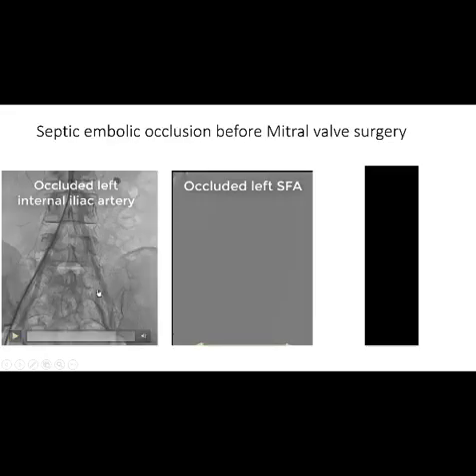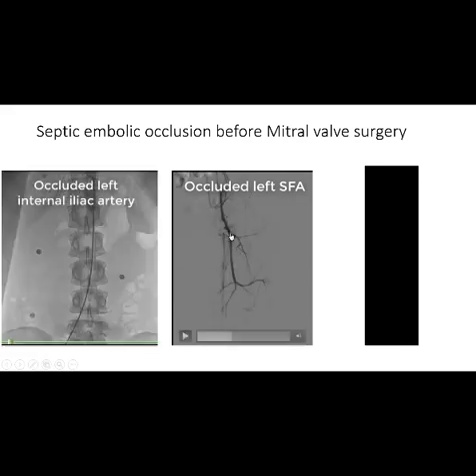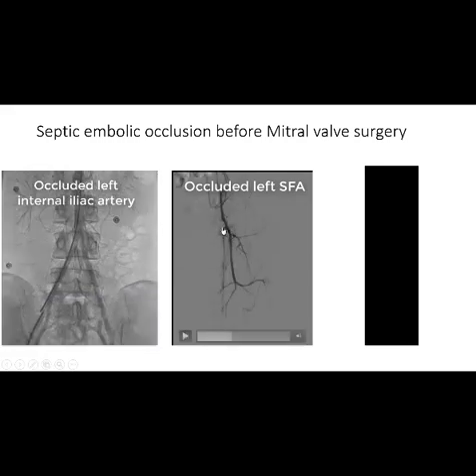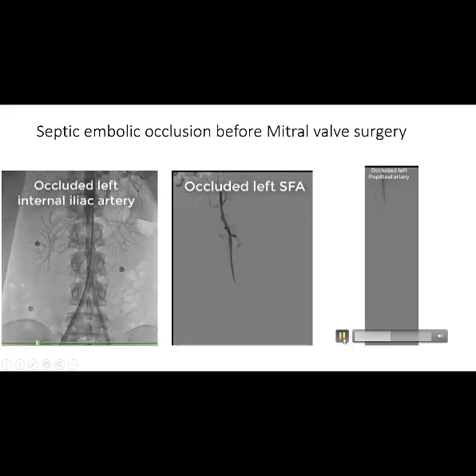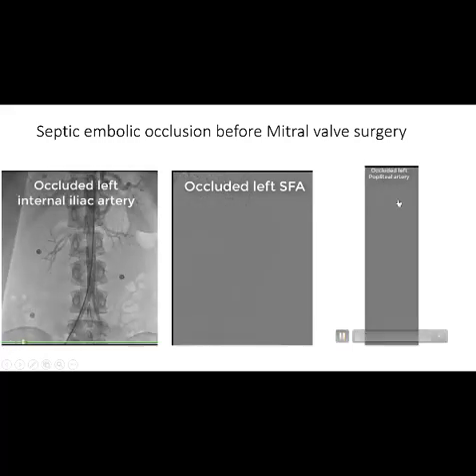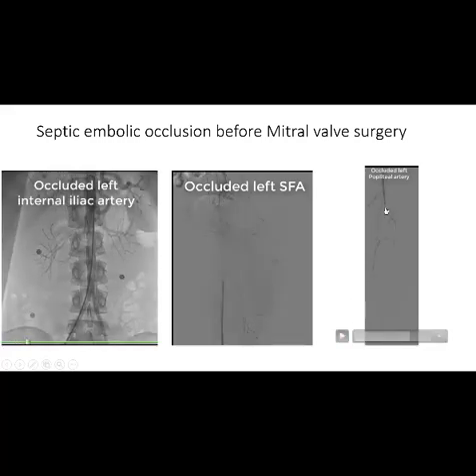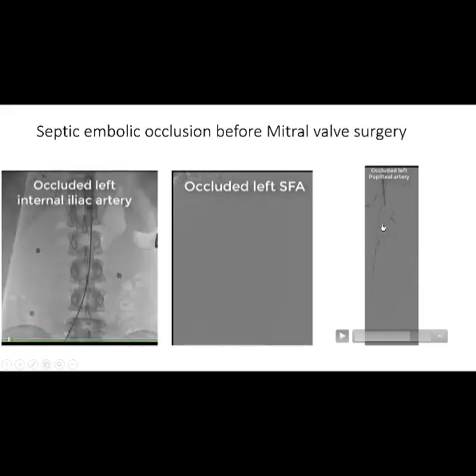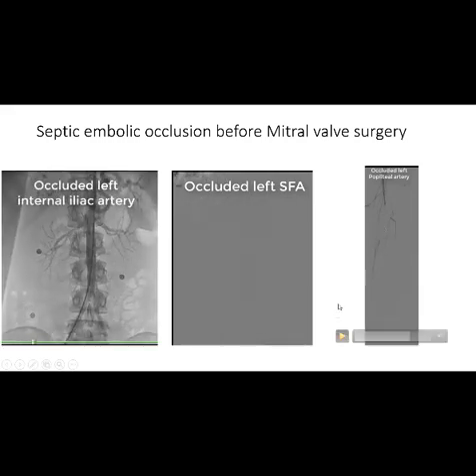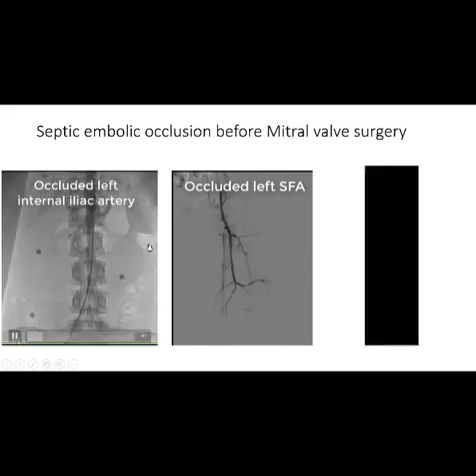You can see the occlusion of the internal iliac artery on the left side. You can also see the occlusion of the left superficial femoral artery at the beginning of this artery, the occluded left popliteal artery at the distal portion, and occlusion of the proximal portion of the tibio-peroneal artery on the left side. So we have occlusion in three different arteries.